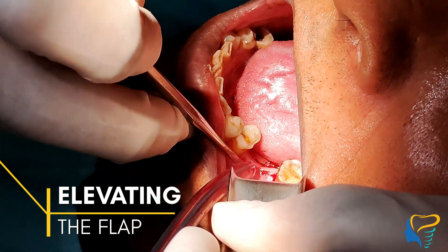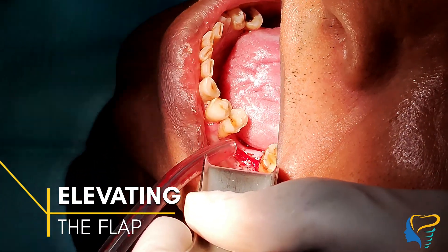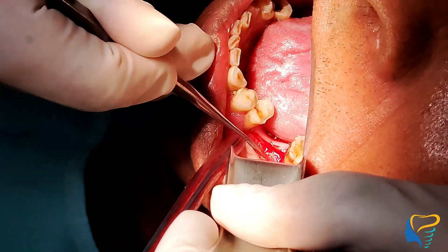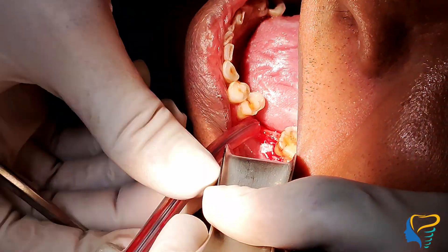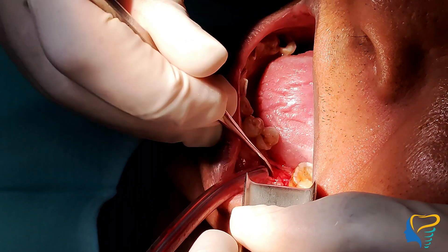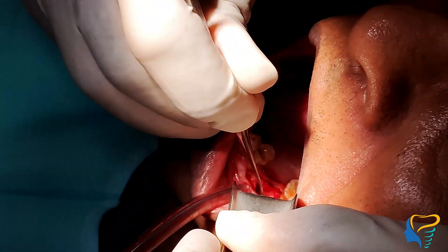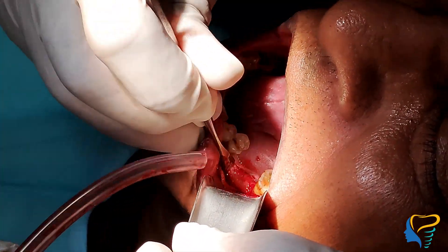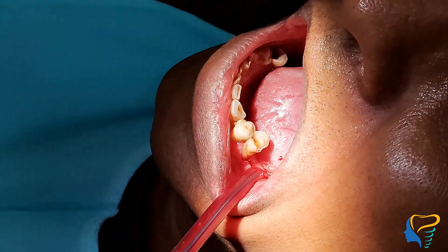Now comes elevating the flap with a periosteal elevator. The dissection should be subperiosteal, reflecting on the lingual side of the area so that we have a complete visualization of the implant placement site, clearing all the leftover periosteum on the crest of the ridge.